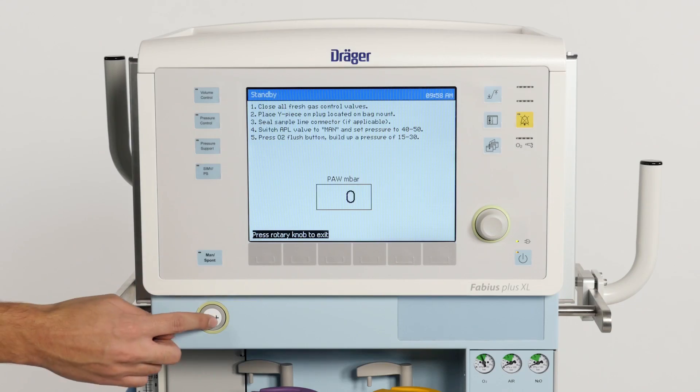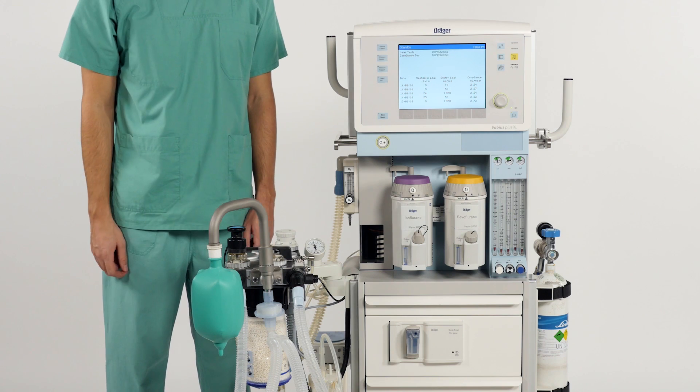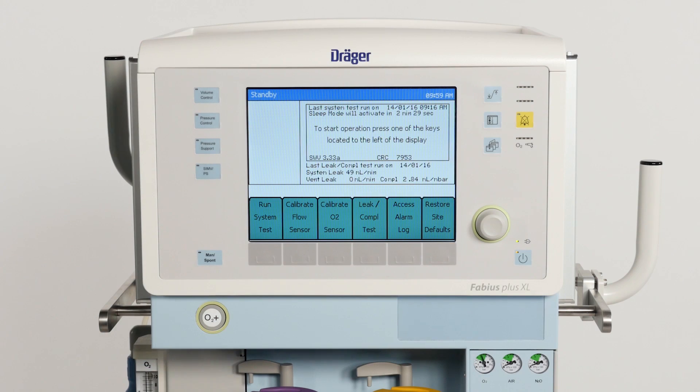Then press the oxygen flush button to build up a pressure between 15 to 30 hectopascal. When the test is completed, the results are shown on the screen. Press the rotary knob to return to the standby screen. On the standby screen, you can see the result of the last system test, as well as the last leakage and compliance test.